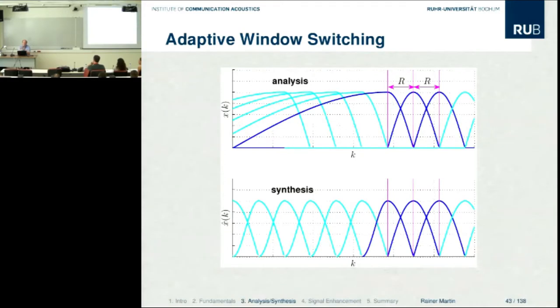In this case, you could use, for example, a pruned DFT, because whenever you use the short windows, you have a lot of zero samples which you get from your window. We have not optimized it to the last bit, because there are lots of variations of FFT algorithms which you could use to optimize the performance or efficiency. But one good approach certainly is to use a pruned FFT algorithm which avoids processing zero samples.